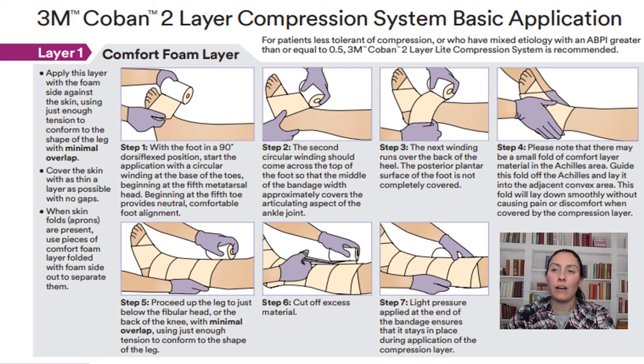The first step of this compression system is the comfort foam layer. The foam has two sides — a white side and a brown side — and the white foam goes against the leg. It's applied with minimal overlap; this is just a comfort layer so the compression doesn't push directly on the skin, acting like a sponge against it. Start at the baby toe with the foot in a 90-degree dorsiflexed position and wrap upward with minimal overlap, not the 50% overlap required for the compression layer.